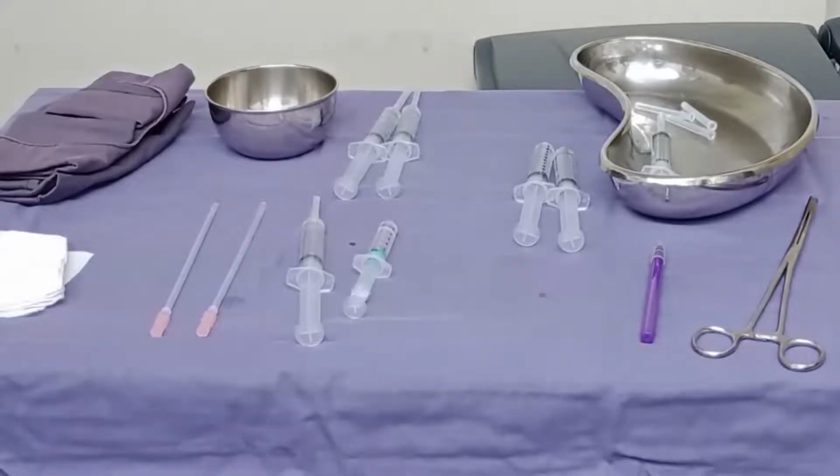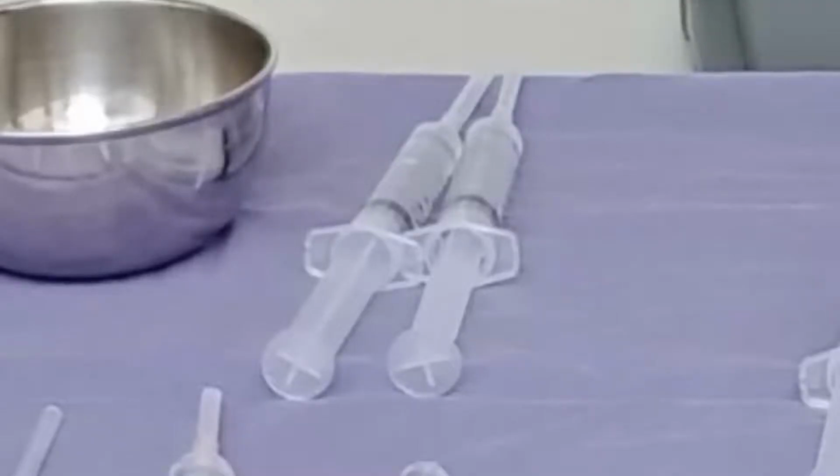For this procedure, the sterile trolley is prepared with all the drugs being drawn up. As you can see, the two 10 cc syringes with the needles have absolute alcohol in them. The reason for keeping the needles on the syringes is to ensure there is minimal evaporation of alcohol.